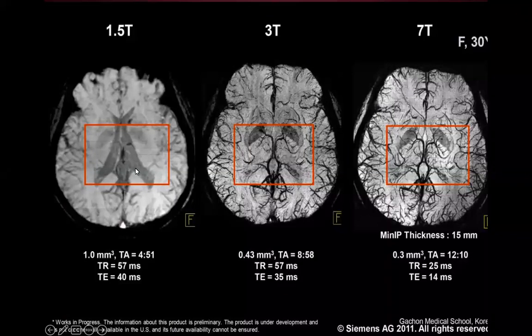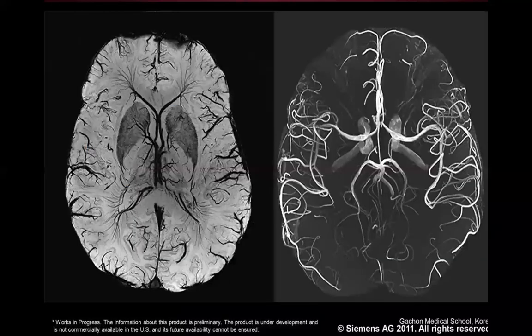Based on the strength of the magnet, we'll be able to better differentiate the tissues. How and why, I'll be explaining later. This, for example, is a 1.5 Tesla image. This, for example, is a 3 Tesla image. Look at the quality of the vessels when it is a 7 Tesla MRI. 7 Tesla MRI is not yet clinically approved.